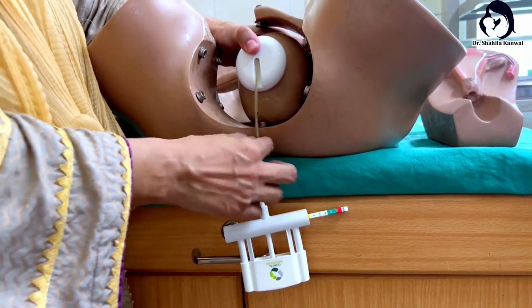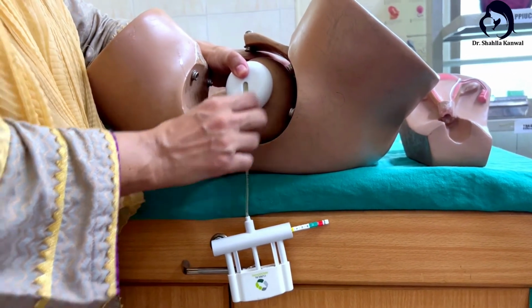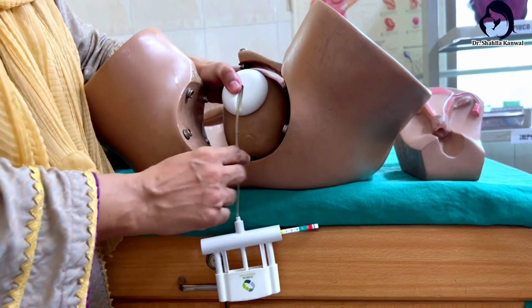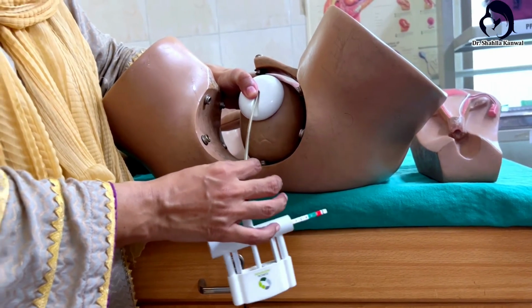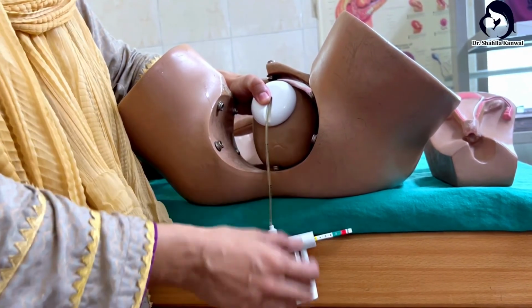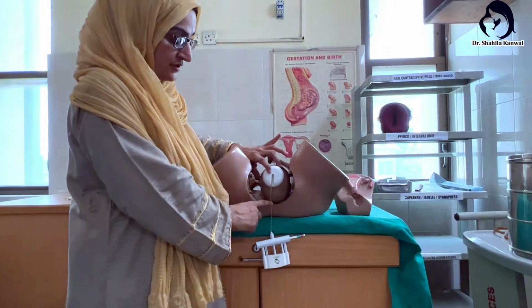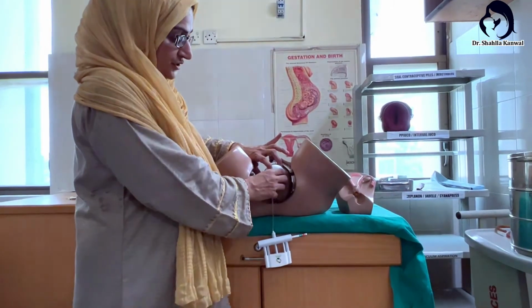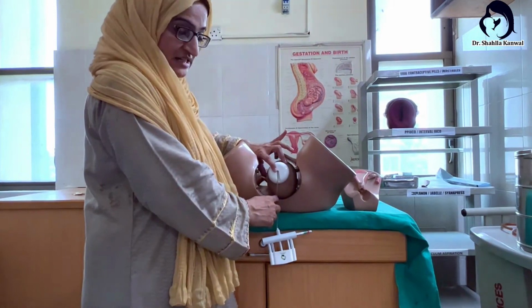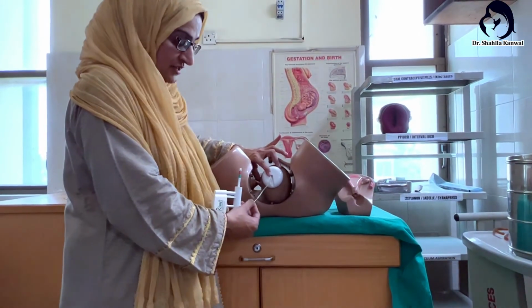When you hang it down, you have to see where it is touching. It should be around 8 cm. If it is not 8 cm, then you have to move the Omni cup more towards the medial side or downward side or upward side, so that the insertion distance which we have measured is matched. Then you have to apply the pressure. Measure with 8 cm. If it is not 8 cm, by touching at the posterior fourchette, you have to move the Omni cup down or slightly towards the medial side, so that the complete 8 cm on the insertion tube is according to the insertion distance.